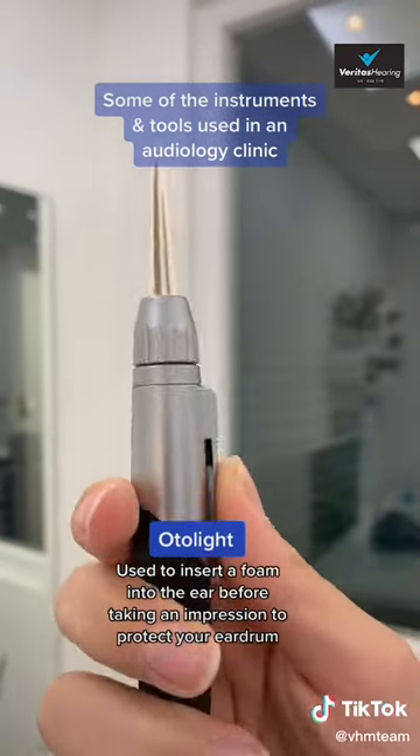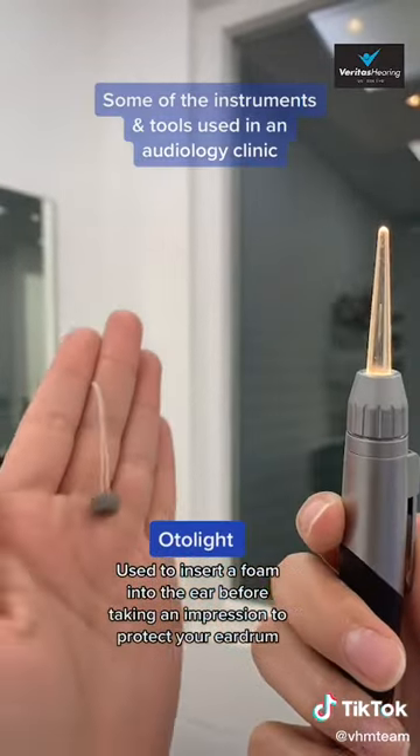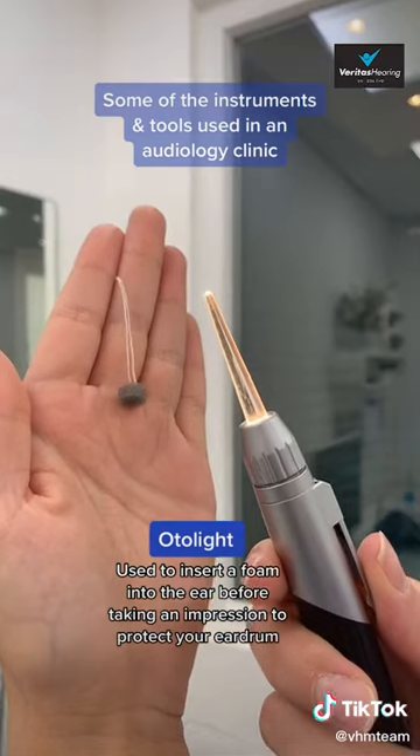This is called an otolite, and it is used to insert a little foam into the ear before taking ear impressions. The purpose of the foam is to protect the eardrum from the material.